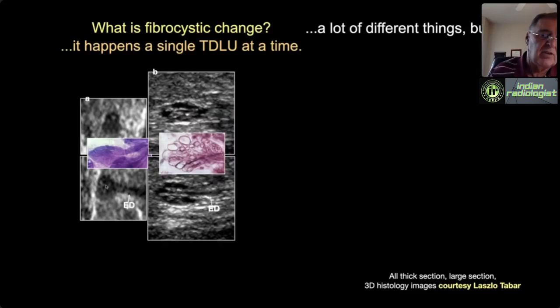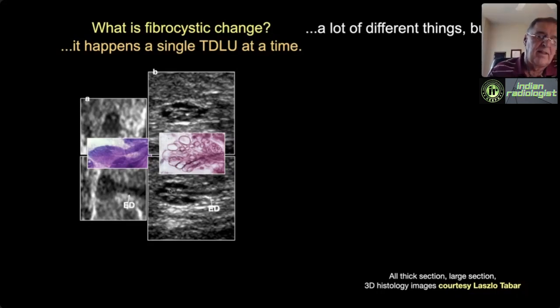In fibrocystic change, the acini become fluid distended. I can see seven fluid-distended or cystically dilated acini. I also see the extra lobular terminal duct and intralobular terminal duct in the center. The normally loose gray stromal tissue becomes abnormally white—that's the fibro part of fibrocystic change.